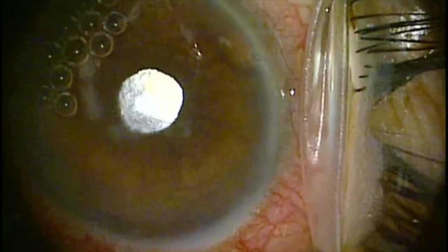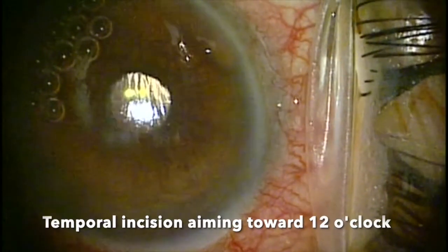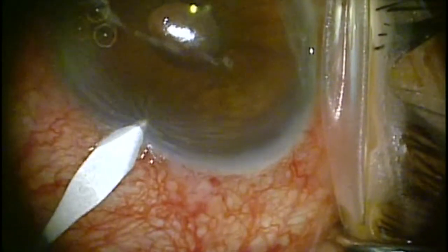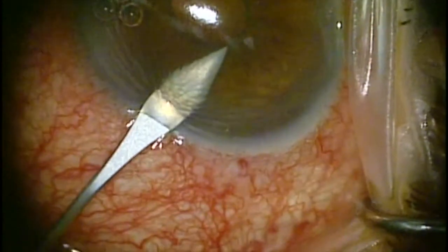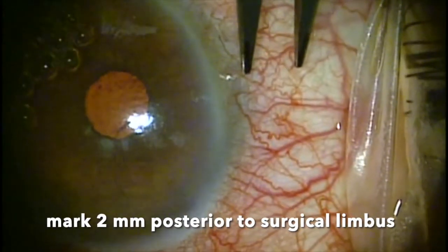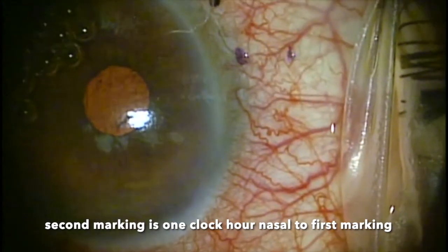Now, if you are going to place the incision temporally, you don't want to aim centripetally — meaning not towards the center of the pupil. For example, you want to aim right to that 12 o'clock marking so that you can insert the Zen Gel up towards the 12 o'clock position.